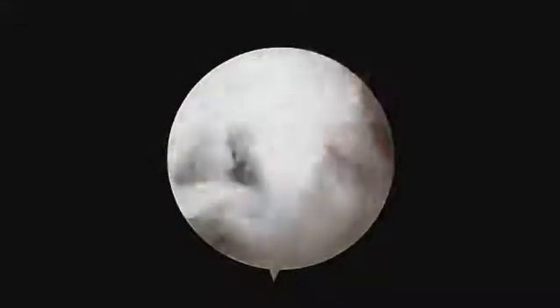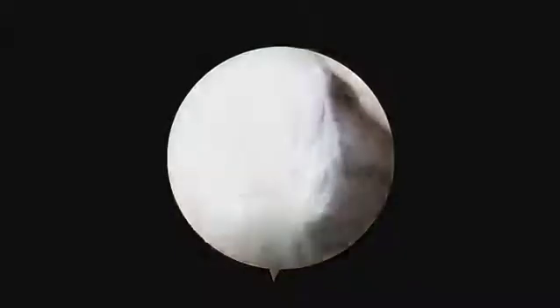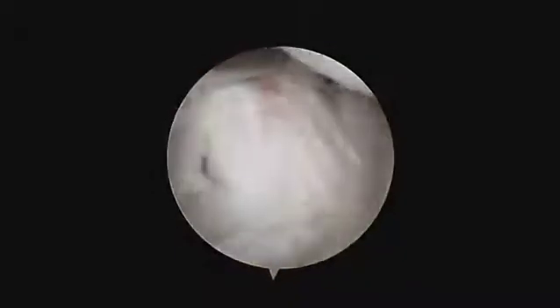The posterior subtalar joint is then exposed and examined for any cartilage lesion. Moreover, the interosseous ligament can also be examined. Any tear or fibrosis can be debrided.